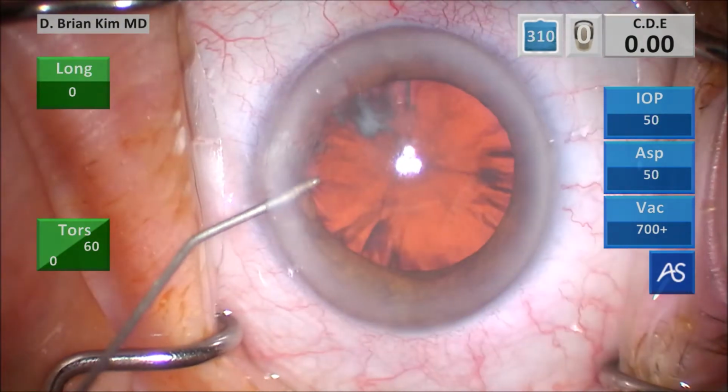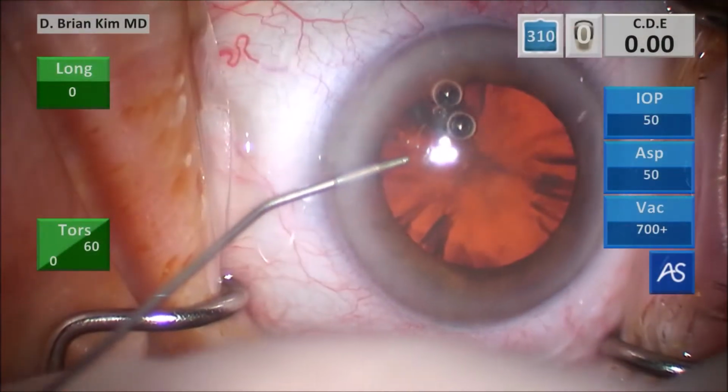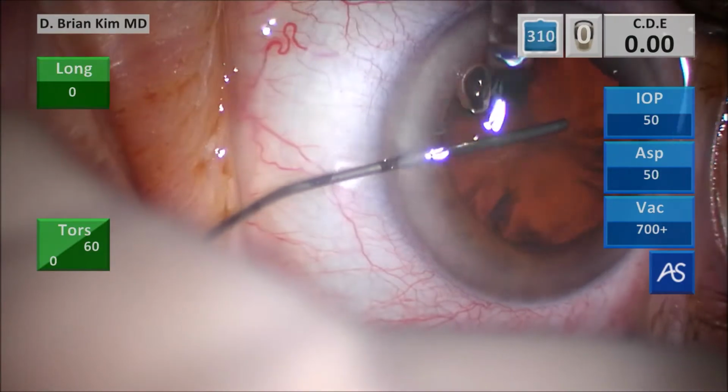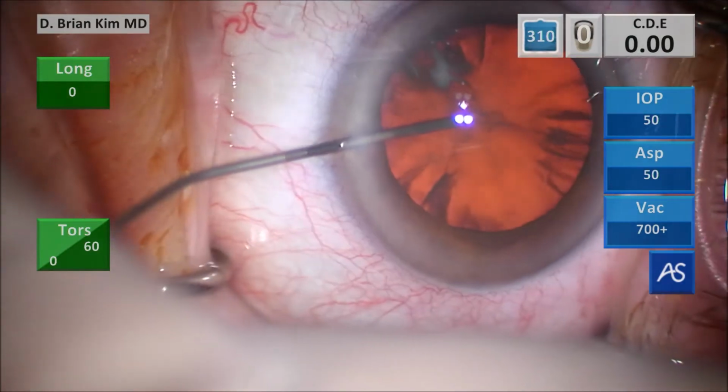I'm using some intracameral lidocaine and then some intracameral epinephrine. And this is dispersive viscoelastic to fill the anterior chamber and coat the corneal endothelium.